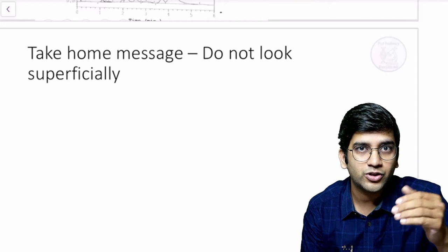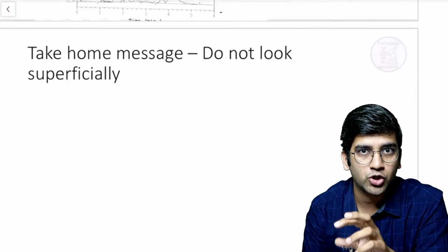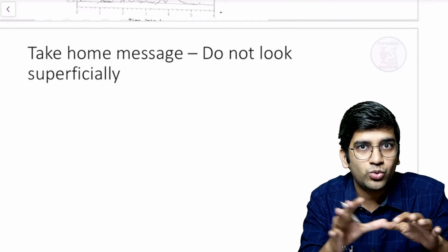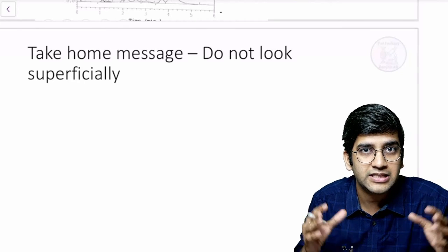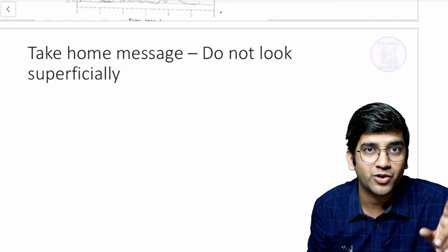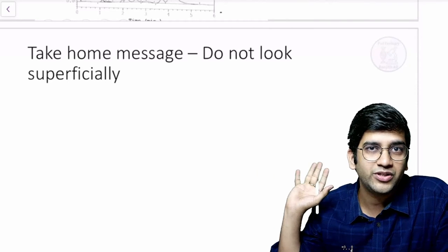First thing, look at the percentages. Next, look at the retention time. Matching or not? Not matching, recalibrate, redo again. Matching, then look at your peaks. A2, I have 3 probabilities, 4 probabilities. F, I have 3-4 probabilities. And if it is in that window, what retention time, come to an answer. Plus, the most important thing, it should match clinically. If it's not matching clinically, I'm definitely doing some error, right?